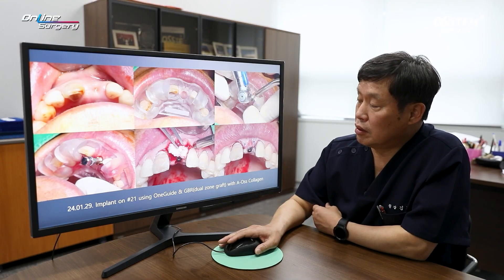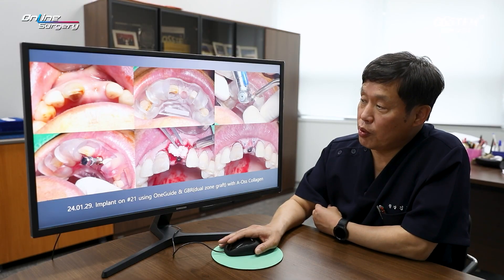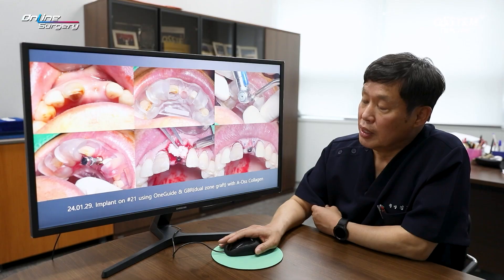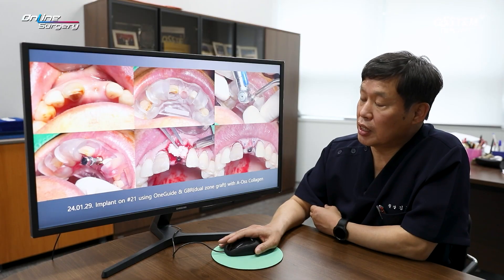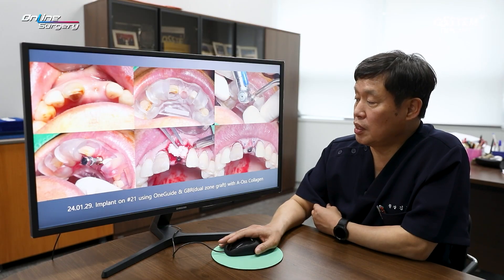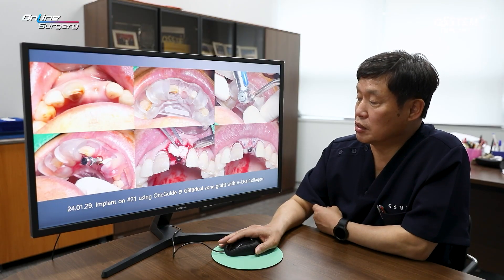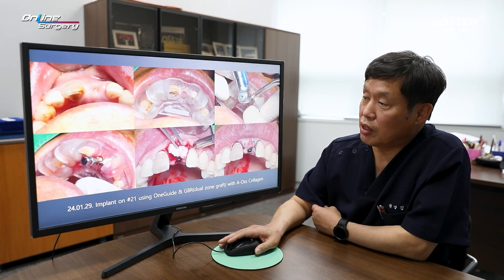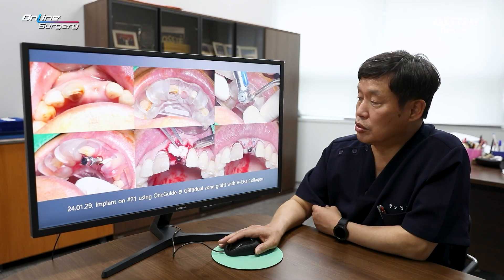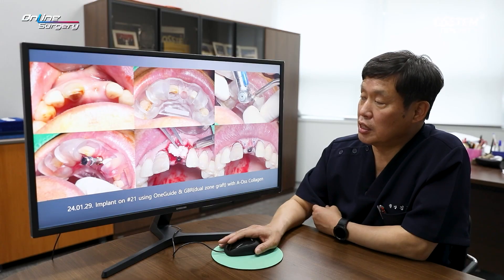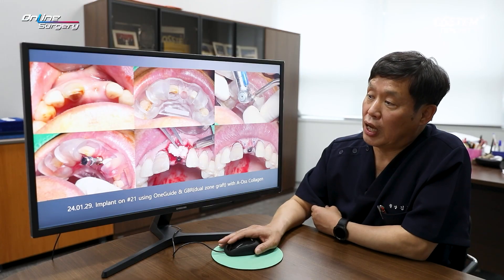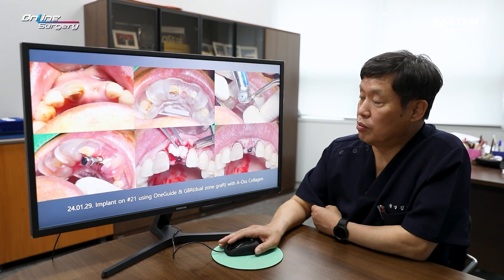Initially, we considered placing a temporary restoration, but due to insufficient stability, we instead placed a healing abutment. The final prosthetic restoration will be done later.